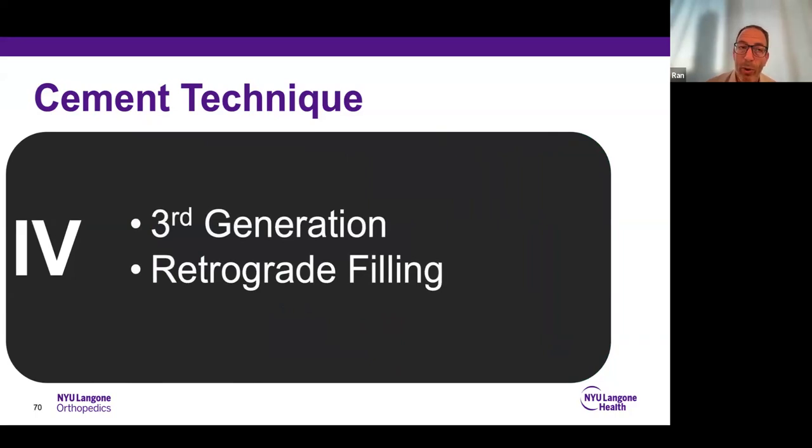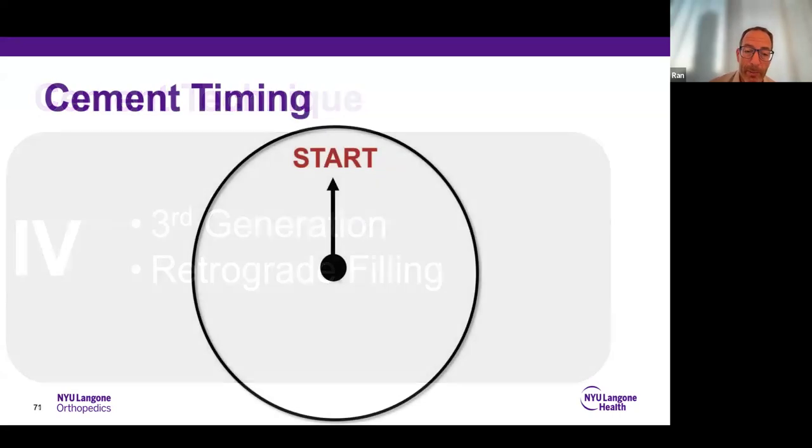I think one of the important things when you use the beam with a collared stem is to make sure you coat the stem with cement as well as filling and pressurizing the canal, because the place you do not want to have blood or tissue is between the implant and the cement in the beam collar type stem, because that can make the stem loose and lose its bonding with the cement.